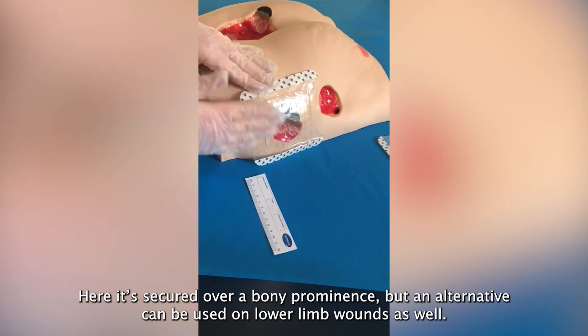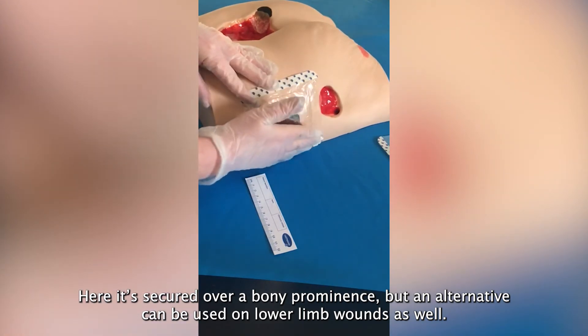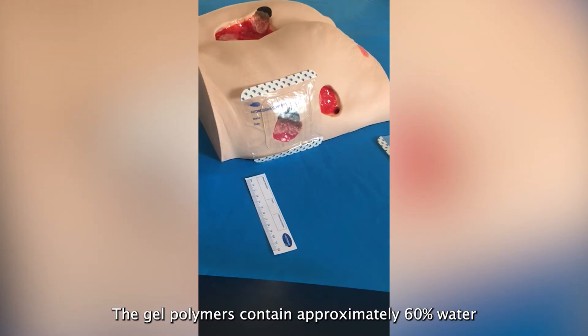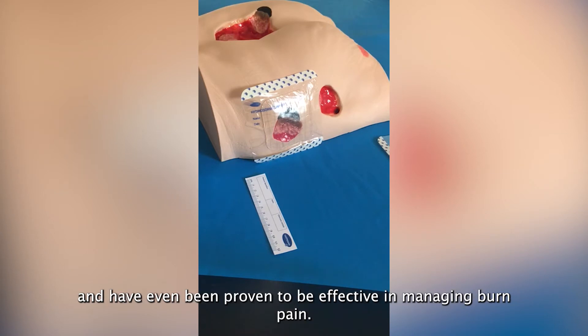Here it's secured over a bony prominence, but a tubigrip sleeve can be used on lower limb wounds as well. The gel polymers contain approximately 60% water and provide a natural soothing effect, really bathing the nerve endings, and have even been proven to be effective in managing burn pain.